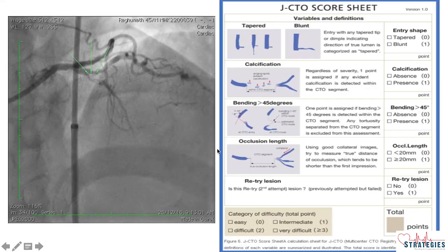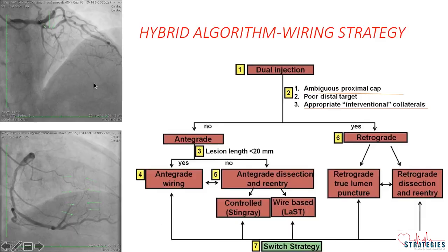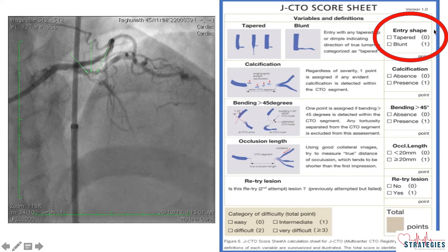Coming to the analysis of CTO, if you analyze with the JCTO score, there is an ambiguous cap. With angiogram we are not able to make out where the entry point is, but it looks like some nipple here but I'm not sure if it is really diagonal or the nipple of the LAD. Angiographically it looks like the entry point is somewhere here, and otherwise this segment is not angulated, there is no calcium, and the occlusion length is less than 20 millimeters. Overall there is only an ambiguous cap, so JCTO score 1 — it is an intermediate kind of CTO.